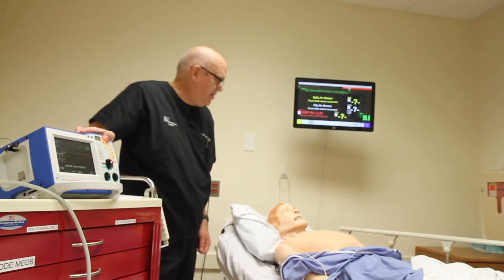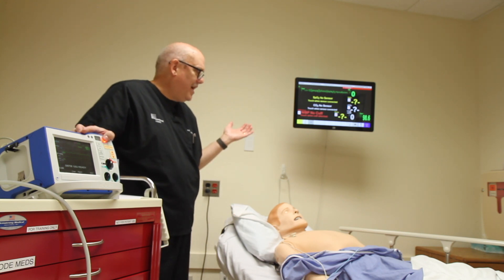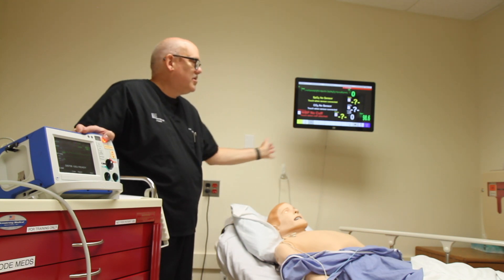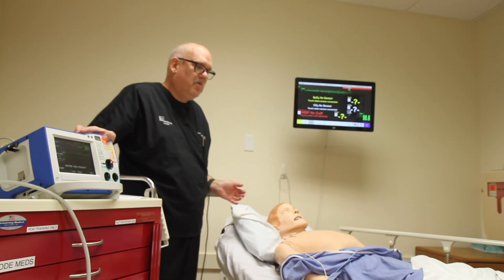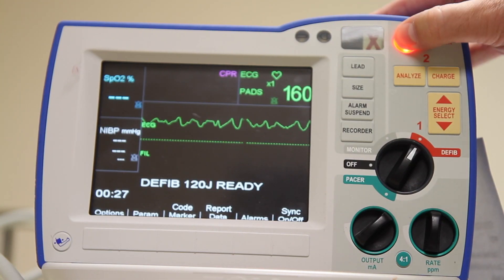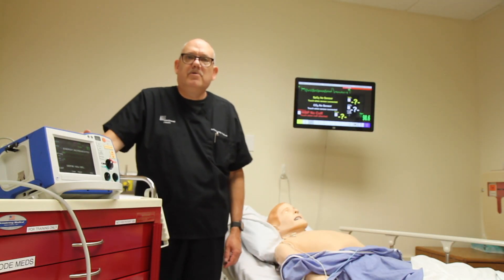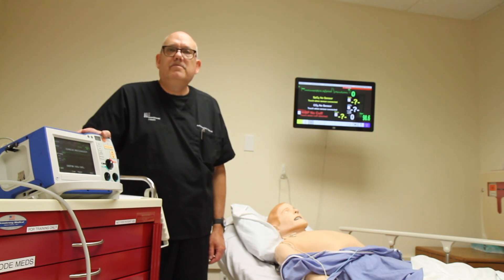I will turn to the patient and announce my intent to defibrillate: 'I'm going to shock. Everyone stand clear. I'm clear. You're clear. We're all clear.' I will do a last check and make sure no one is touching the patient or anything touching the patient, and I will discharge the device. That vibrating sound that you hear is the thermal printer printing out a strip of the defibrillation.